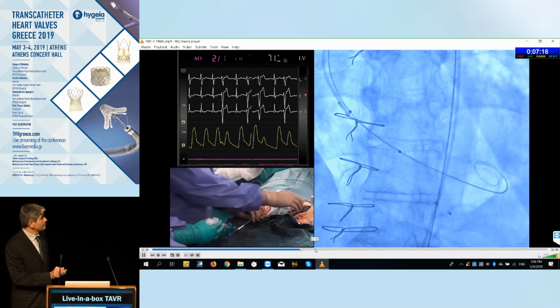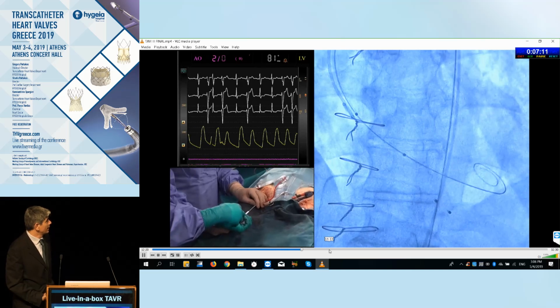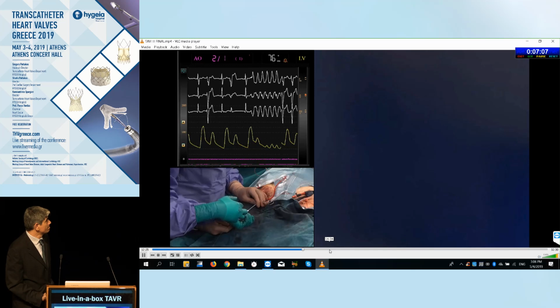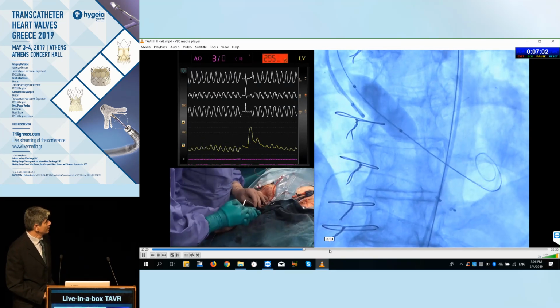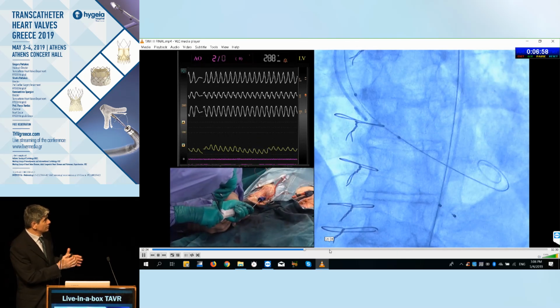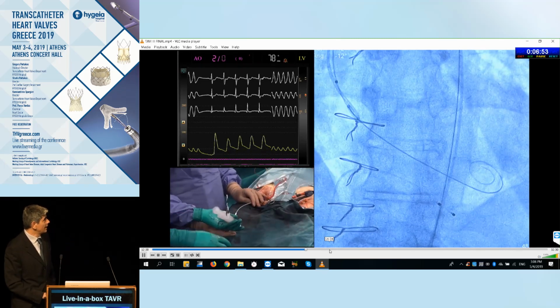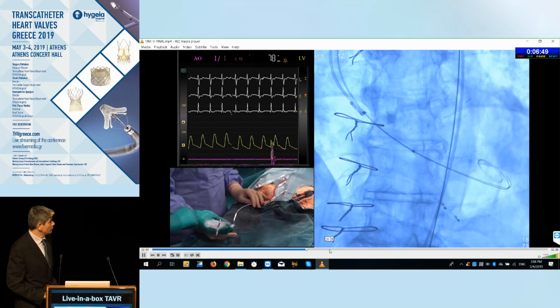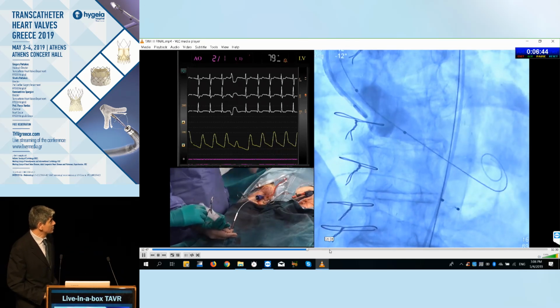Yeah, you see very calcified aortic valve. Nothing is moving on the leaflets. And so rapid pacing, have drop in blood pressure. It's a small balloon, but what we wanted to do is give it a gentle massage on the valve to make sure that we don't have any serious difficulties expanding the Evolut Pro valve once we're there, and then if need be, we'll do a post-dilatation.